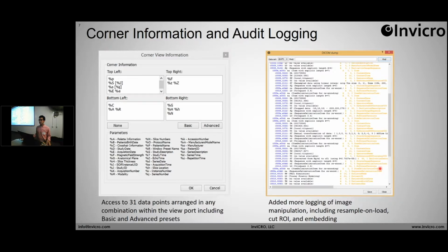We've really enhanced that here to make it very complete, so that a user can go in and not only see what was done, but also easily reconstruct what steps were done if they were to do those steps all over again, because they have those parameters at their disposal directly in the header.